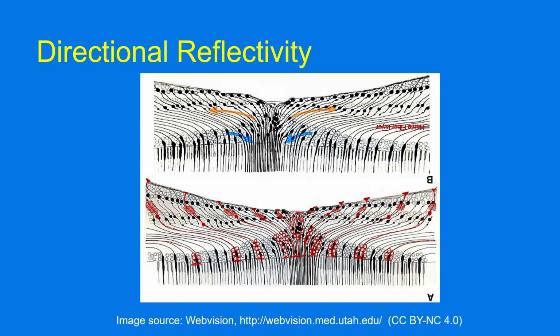Let us consider the structure of the macula. We note that the layers of the retina which are traversing the thickness of the retina are mainly photoreceptors and Muller cells. When the rods and cones are reaching towards the fovea from the entire retina, the rods and cones at the macula are oriented in a slanting pattern towards the fovea. The retinal layers at the fovea are vertical. However, when we move away from the fovea, the layers are slanted, and then again in the parafovea and peripheral retina they become almost vertical.